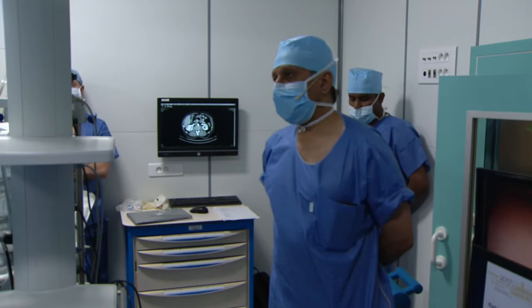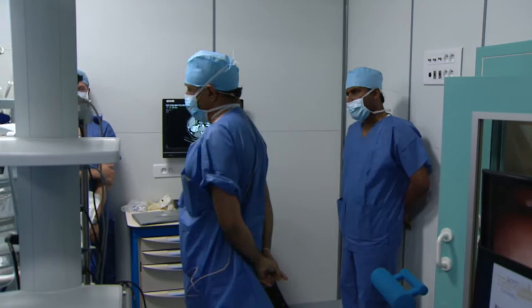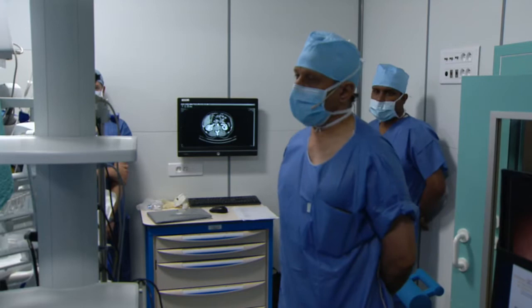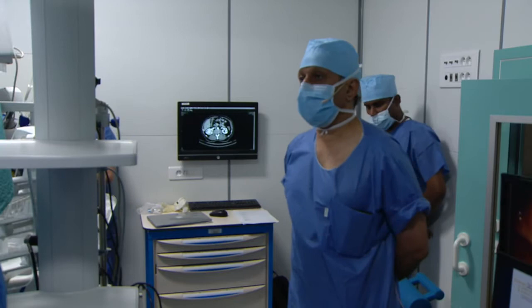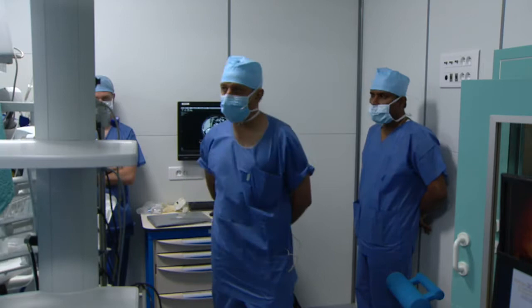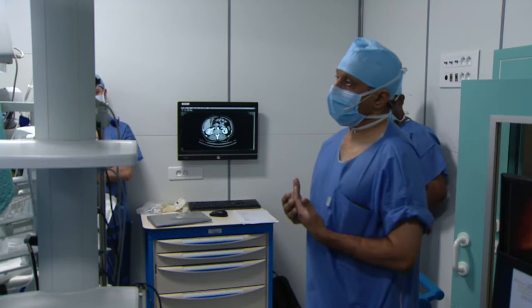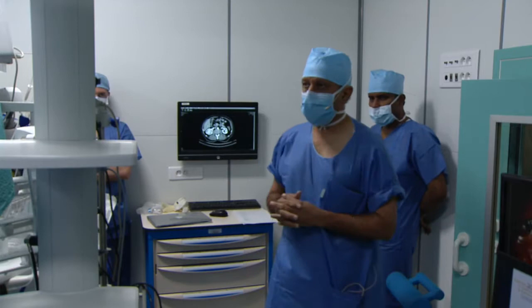We'll obviously be clamping the main renal artery and main renal vein, and do some dissection to see if we can find the posterior branch that is going straight into the tumor. We can just take that up front and then basically go through the scored area of resection and see what we get. If we can get the tumor off the kidney and yet retain some vascularity, then we will probably stay with the partial. On the other hand, if during surgery I really feel that the arterial supply, et cetera, is so tightly connected with the tumor that teasing it off is oncologically not adequate, we will just do a radical nephrectomy. This is one case where you don't want to indulge in major heroics.